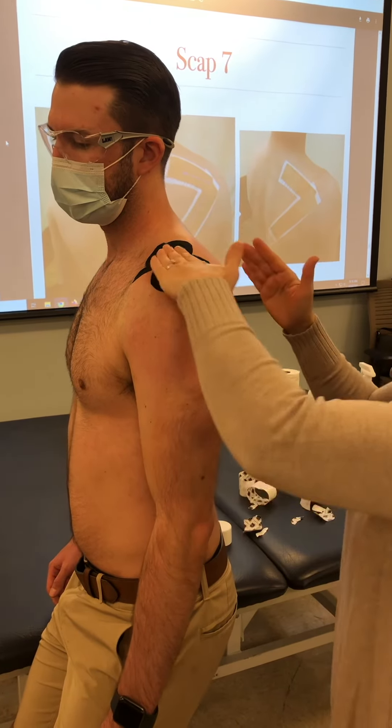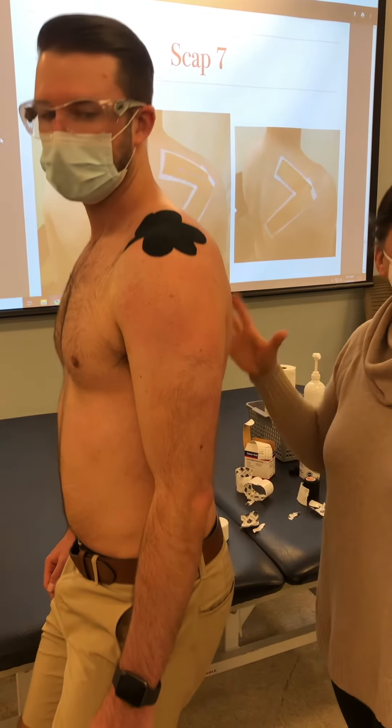We're just doing our nice star technique. And if I wanted to put one more — just so you know, for his height, I wouldn't have him sit down. Mechanically sound for all of us. And then you would still do that aggressive rub to get that adhesive to stick down. But now you see we've got it just localized.